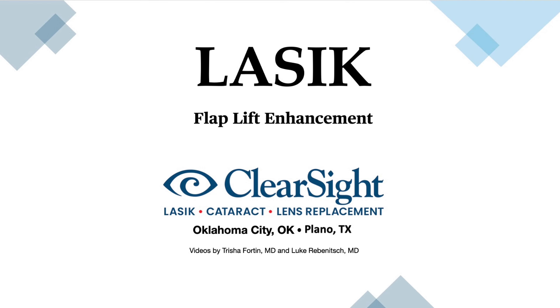Hi, this is Dr. Fortin from ClearSight in Oklahoma City, Oklahoma. In this video, I will be showing a LASIK enhancement done by lifting a flap that was created previously.